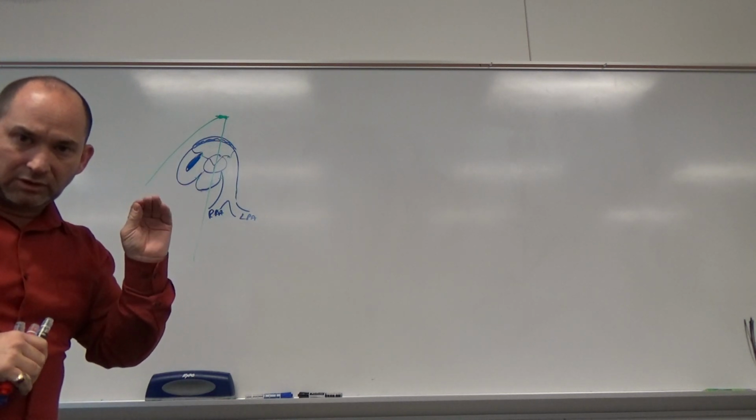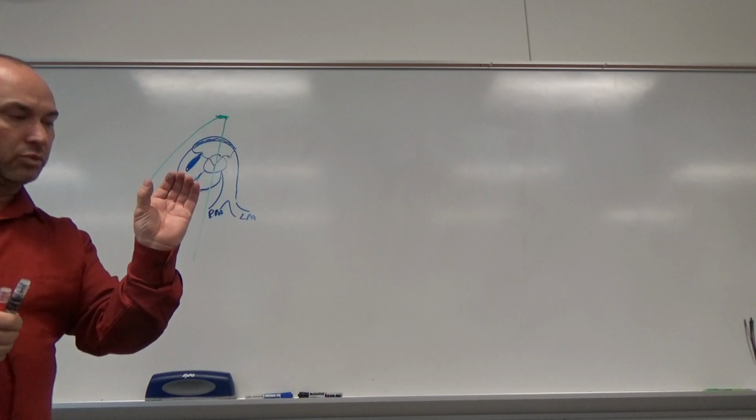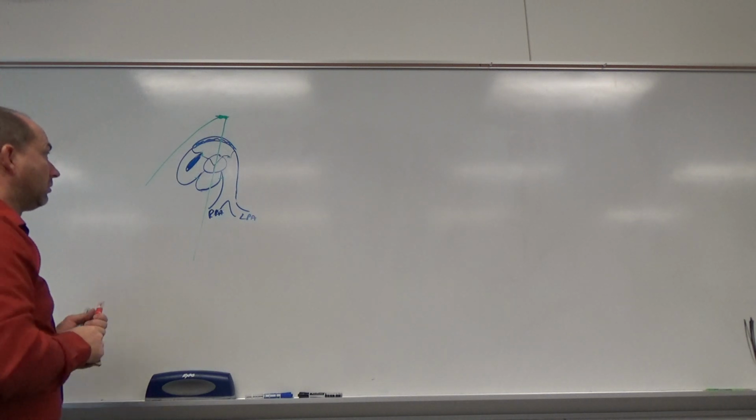So first we're going to take a clip in 2D of it so that we can see that the valve is coming together properly. You can see some images on hearts where it comes together, but then there's a gap that's left at the end of it. And then when you stick color Doppler on, that's even more significant.